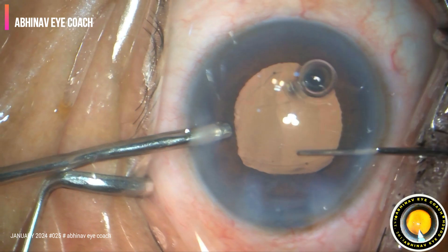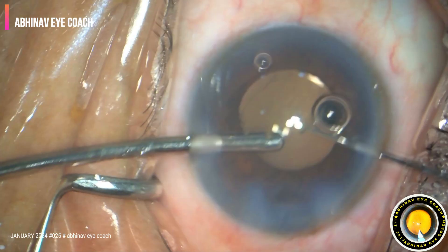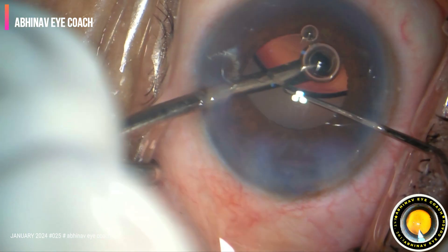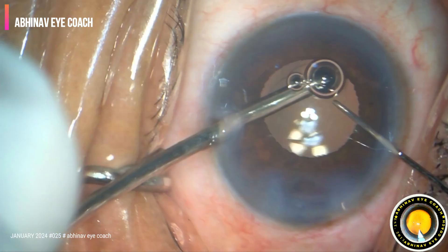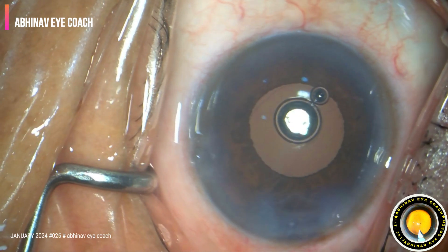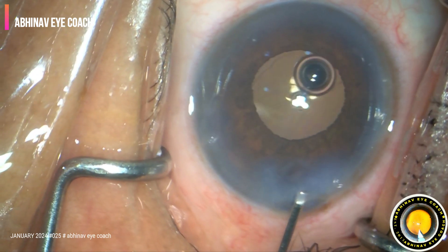Sometimes this hydro implantation saves your time and cuts the duration of the surgery. The visco removal is a lot easier — you don't need to spend a lot of time on visco removal. Just go behind the IOL and the little bit of viscoelastic which is there will come out with the irrigation cannula when we are sealing the side ports.